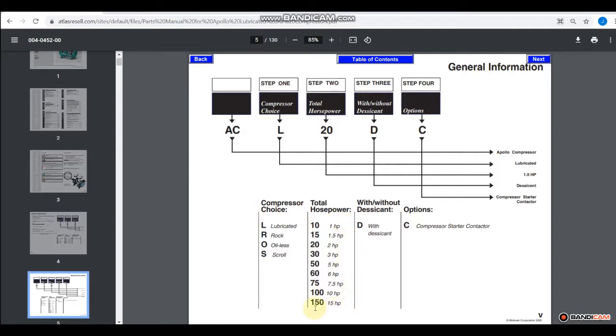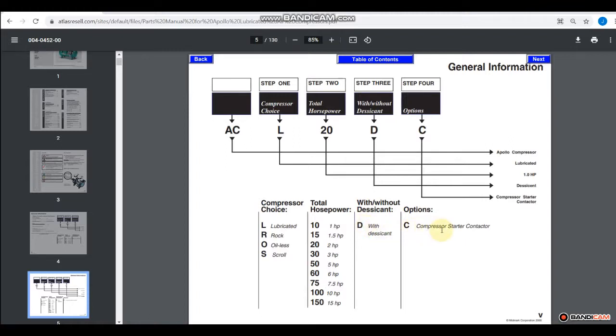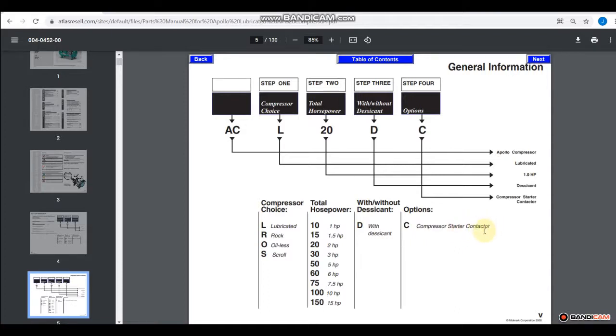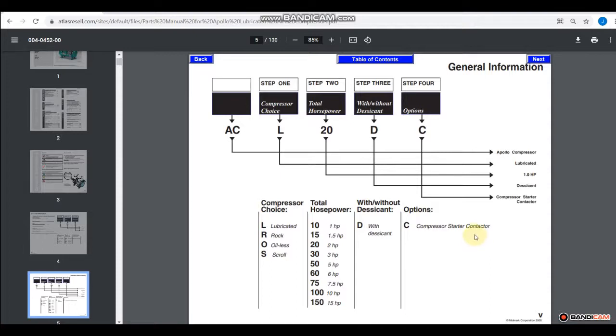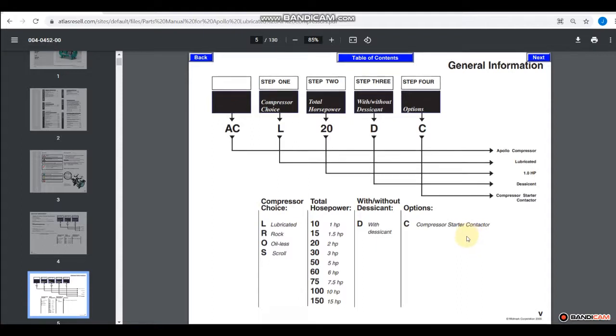Now I won't really get into what horsepower is, but basically it's a measure of energy. And again, here with desiccant, and then options, compressor starter contactor. And that would be like a wall mount contactor. A contactor is something that takes a low voltage and then controls a higher voltage. So instead of turning a compressor on and off by applying and removing 230 volts, you turn it on and off by applying 24 volts. And we'll have an opportunity to look a little bit later on as far as how that works.